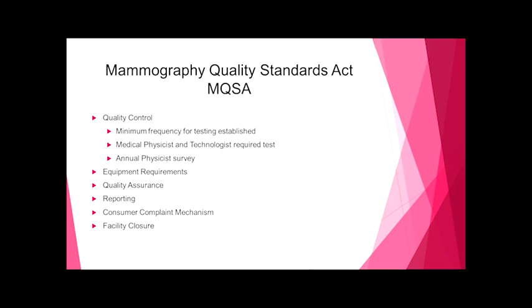how you're improving the process of communication of image quality, which is what we're going to be talking about today, and being able to make that transition into documenting what your process is for establishing what's going to be acceptable and what's unacceptable and how that is going to get communicated.